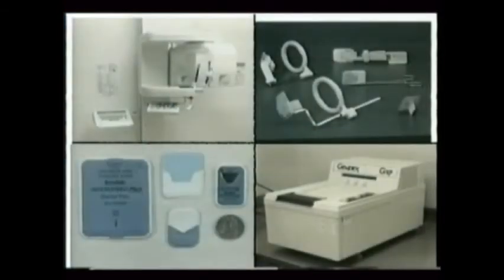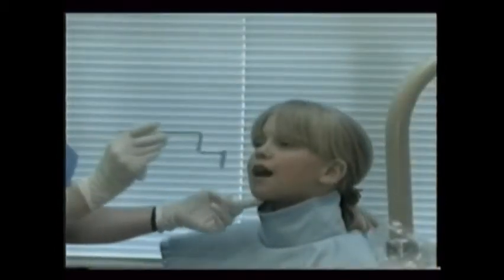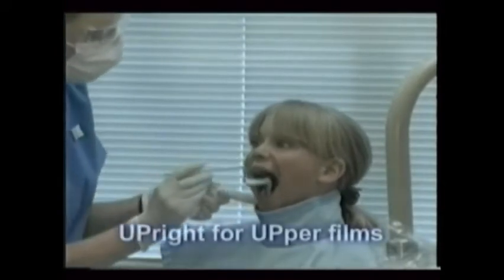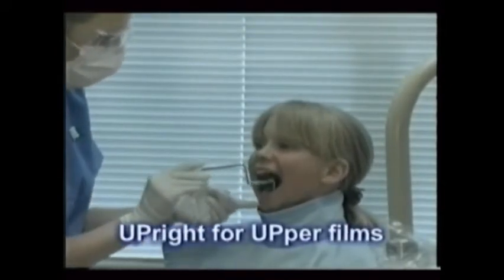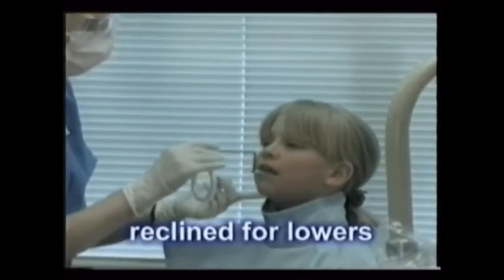There's a wide variety of film combinations. You may be asked to perform a full mouth exam, bite wing x-rays, or both. You may be taking a single x-ray of an emergency patient. Preparation is the same for all. Position the patient in the chair according to the films being made — upright for upper films and bite wings, and slightly reclined for the lower films.